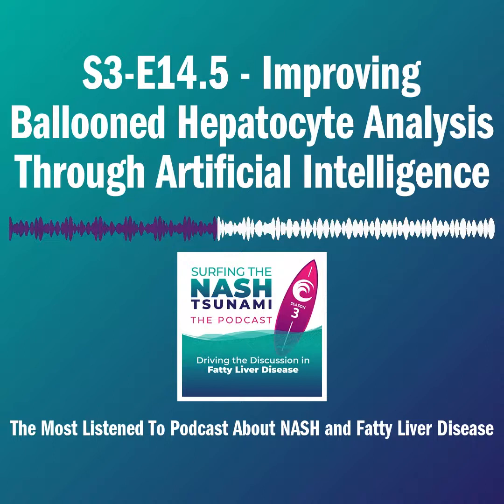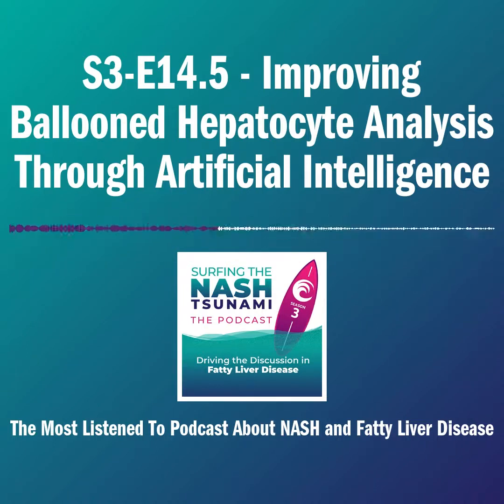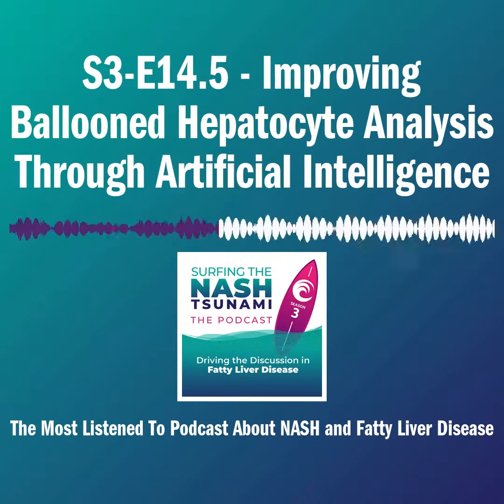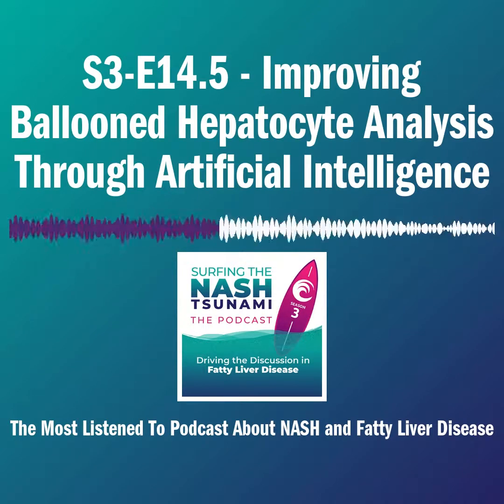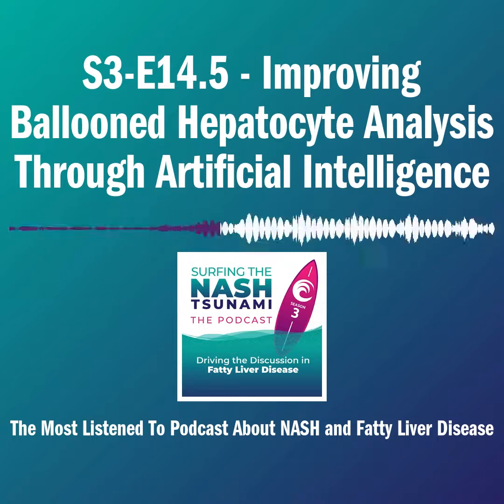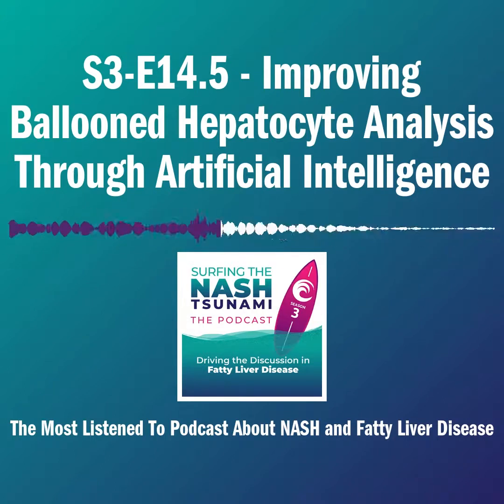That means pathologists, at some level when they evaluate, are affected by the fibrosis around a balloon hepatocyte. When we later talk about it, the pathologists all acknowledge that they are aware of that, despite this not being part of the requirement for ballooning. So this is basically what we are looking into as well.